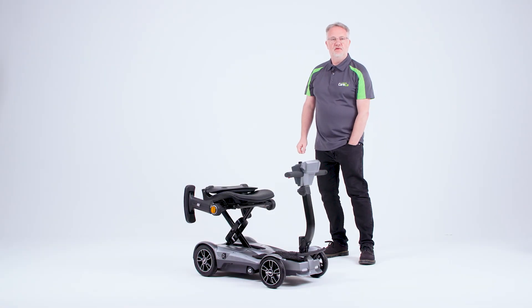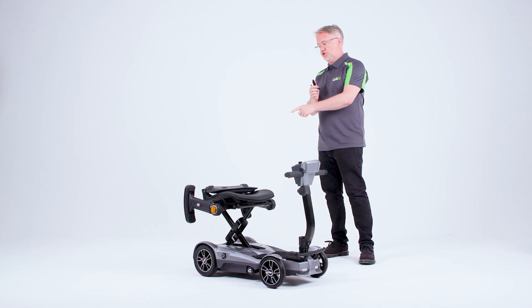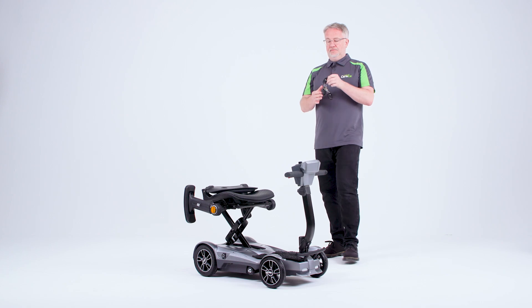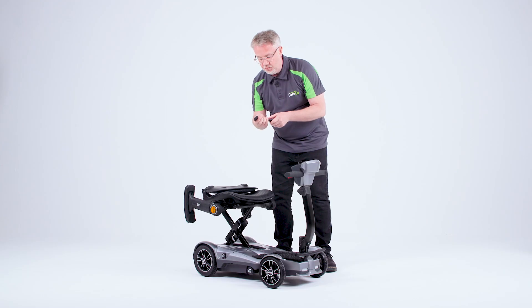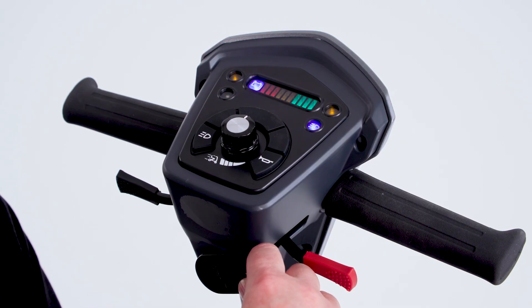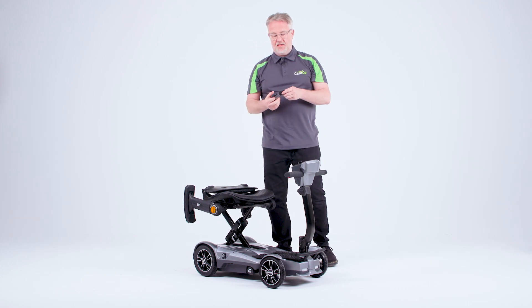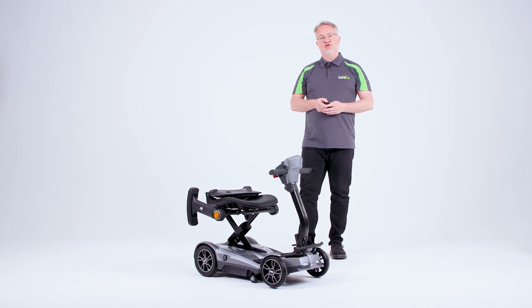In order to fold the scooter, I have some keys in my pocket. However, rather than the traditional key that you would use, these come with some key fobs and a remote button in order to fold the scooter. There are also two buttons at the rear of the scooter which can be used to do the same operation. We start by pressing the scooter button on and then with the key fob, the scooter comes to life and then we press the button one more time. With the remote, we can then press the button and the scooter starts to fold as you can see here.